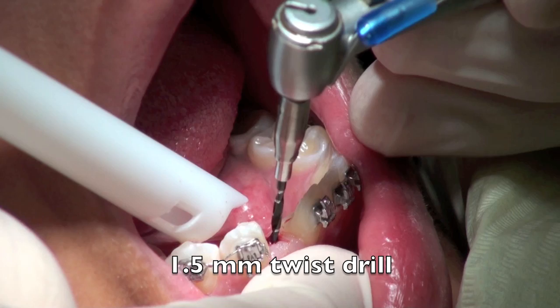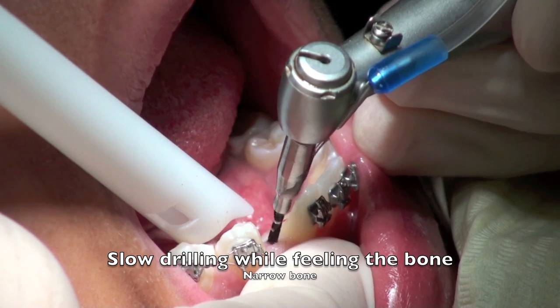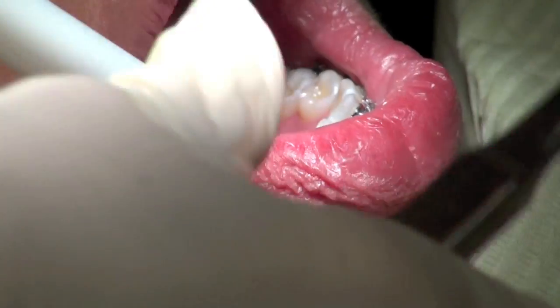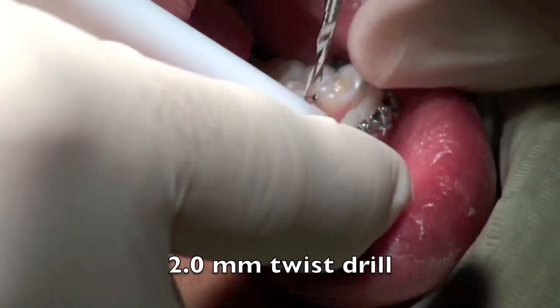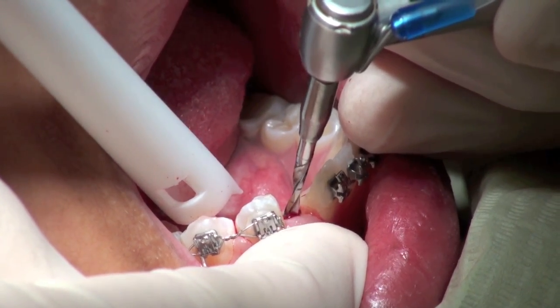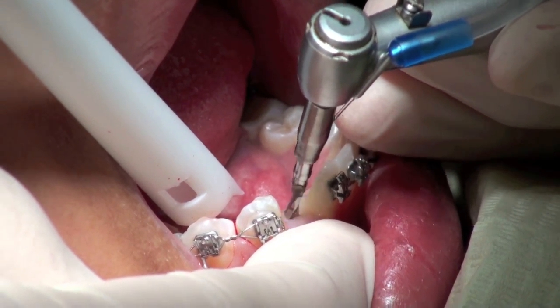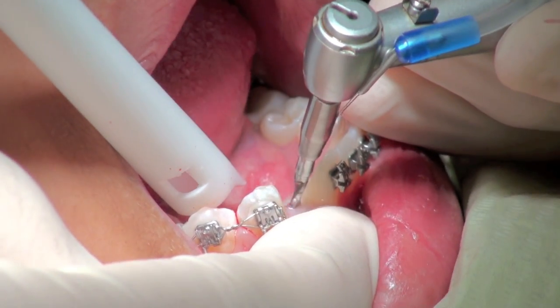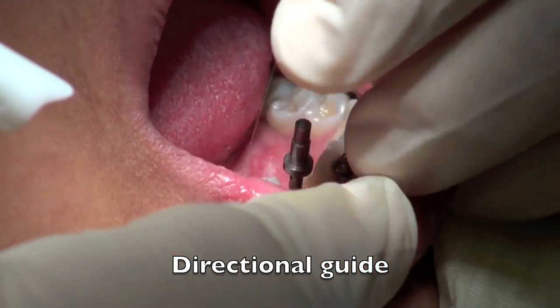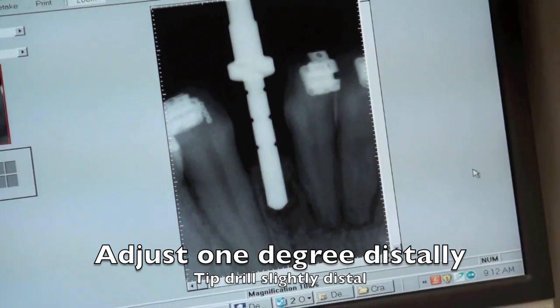We're going to switch to the 1.5 millimeter twist drill, which will be the first drill in for the NobelActive 3.0 millimeter implant. You can actually use the tactile feel to sense the lingual plate, which will enable you to keep on target. We're then going to use the 2.0 millimeter twist drill, which follows the exact position of the 1.5 millimeter drill. We're not going to full length at this moment — we'll take an X-ray with a directional indicator to check that we're on target. An X-ray is a good idea to check your angulation, and visually you can see with the directional guide that we're on target.